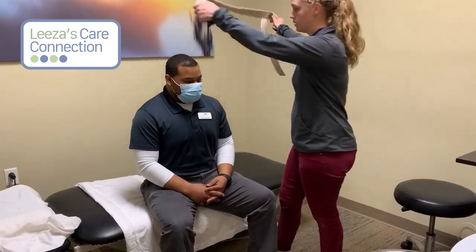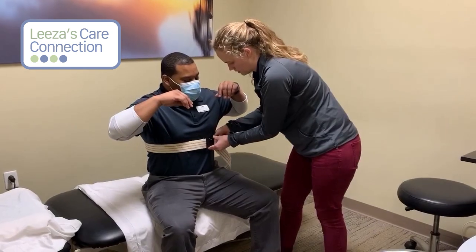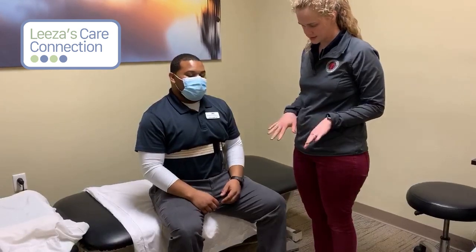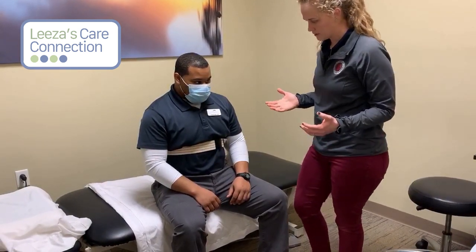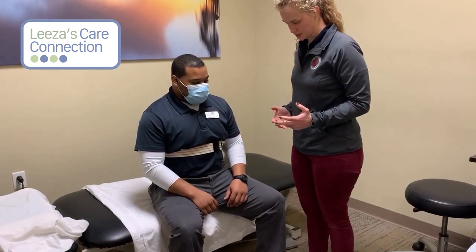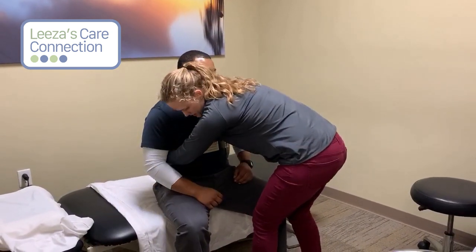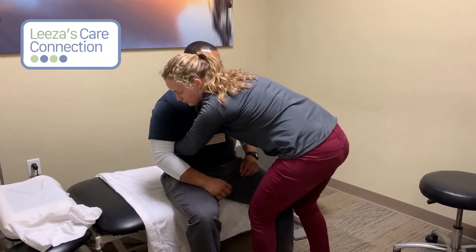Using a gait belt helps give you a leverage point, so you're just going to put it around them and snug it up. The best thing to do is use your knees to help block. Rather than just pulling up on them or letting them push and pull on you, the best way to protect yourself is to get up close. You're going to reach around and put your hands underneath the gait belt, then block with your knee and do a count of three.